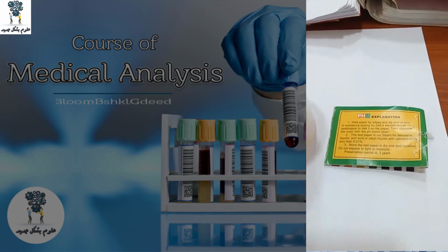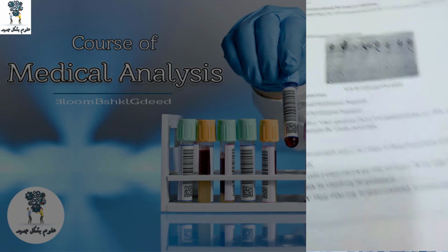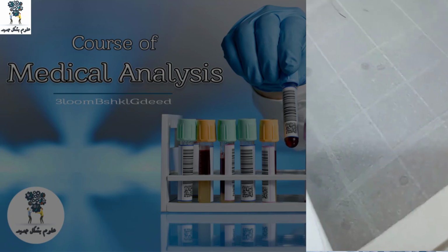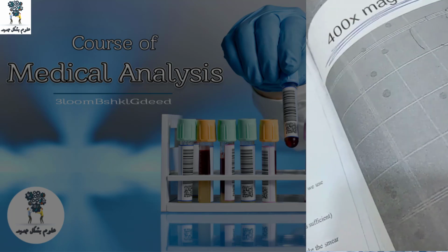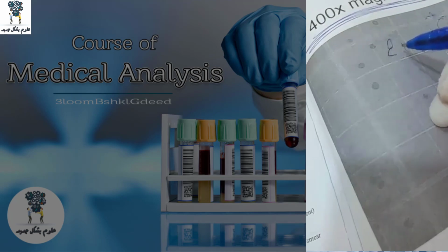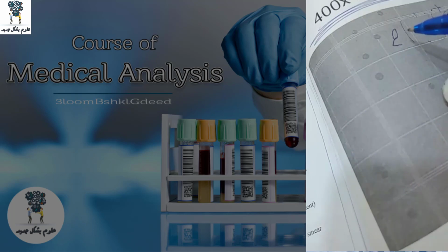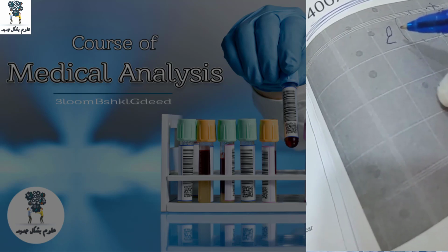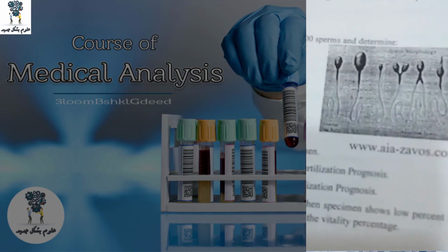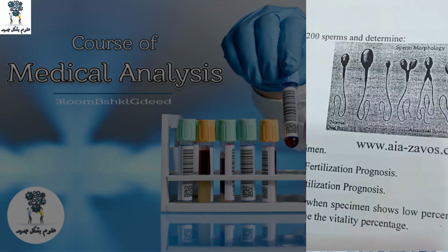After that, we will identify the shapes of sperm. In the count slide, we will have different sperm. So what will we do? We will count sperm and identify the shape of each sperm. There are normal sperm and abnormal sperm. What is a normal sperm? A normal sperm has a normal head, neck, and tail.